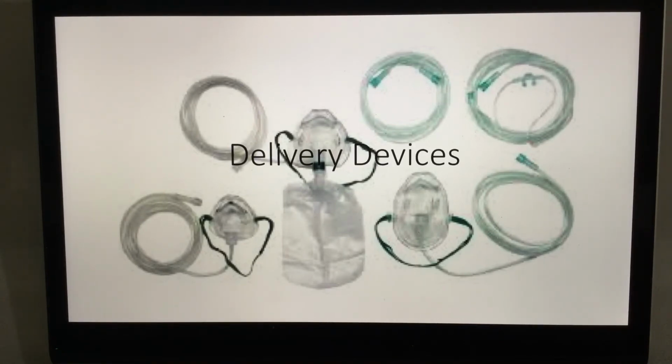So the caveat here is when we are using this non-rebreather mask, it's to set this flow meter at 10 to 15 liters so that bag stays inflated. In some cases, patients may be breathing quite deeply, so that at 10 liters, they're able to totally deflate this bag. In that case, we want to make sure that we increase the flow meter. This is the end of the regulator, and we want to increase that flow meter from 10 to 15 and perhaps even up to 20 or 25 liters per minute. But the caveat is to make sure that we keep that bag inflated at all times.